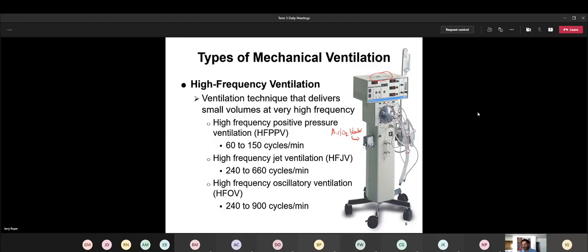And then, it's not really clear on this picture here, but you'd have to take another tube and run it from your blender into your humidifier here. So this is how you're going to get your oxygen into the system.